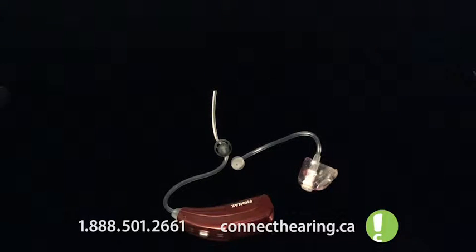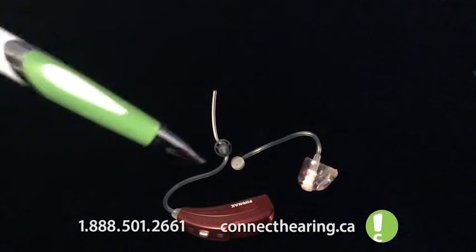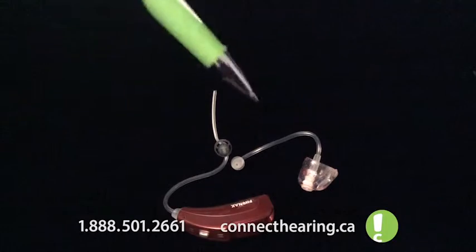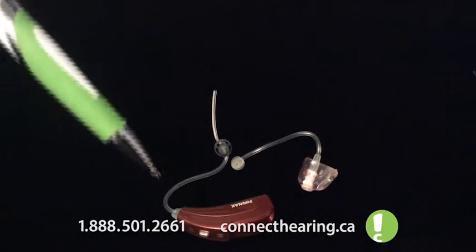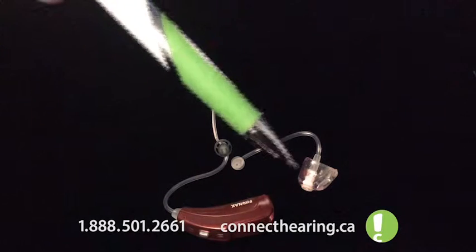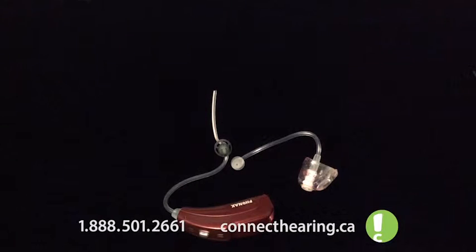So on display here, I have a standard behind the ear hearing aid with the open fit tubing option with a rubber tip and also with a custom slim tip. The use of them is the same. They both have a Cerostop wax guard and I'm just going to show you how to clean them and keep them working.